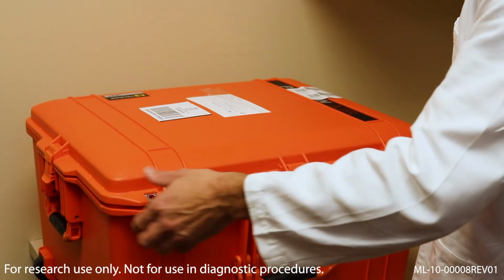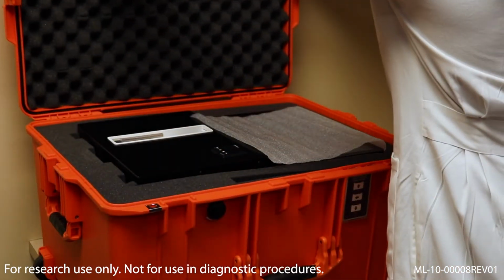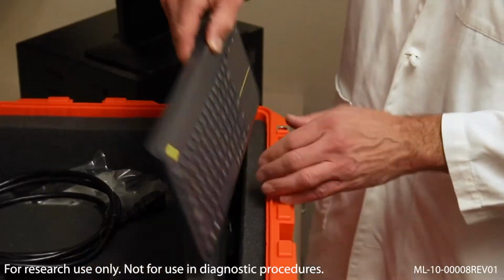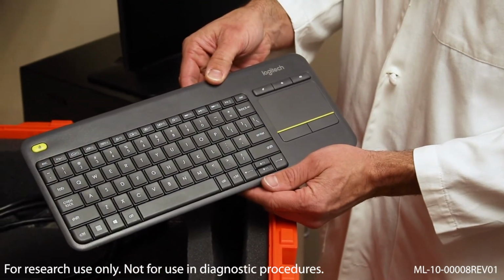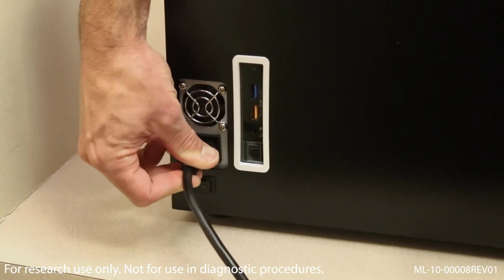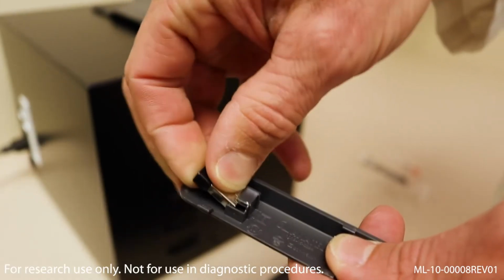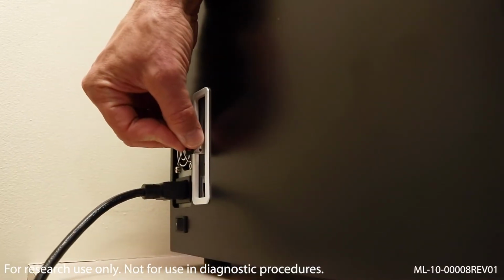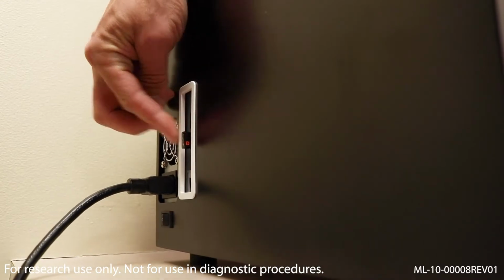The Atlas PST is delivered in a hard, protective case. Carefully unpack the instrument and attached monitor. Remove the keyboard and other accessories. Next, plug the power cord into the back of the instrument and into a standard 110-volt outlet. Remove the USB dongle from the battery compartment of the keyboard and plug it into one of the USB ports on the back of the instrument.